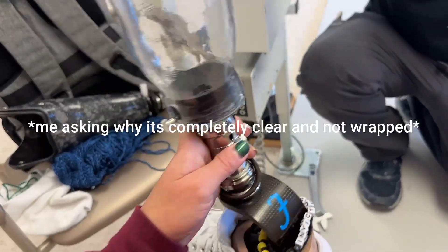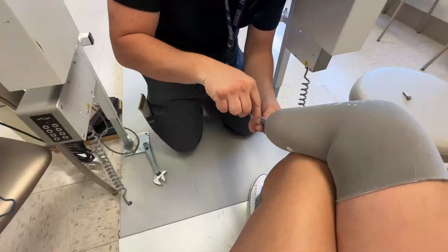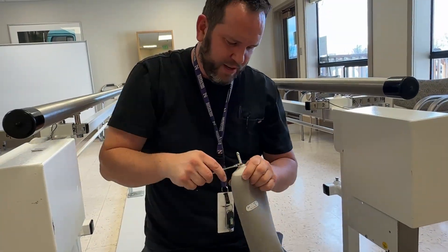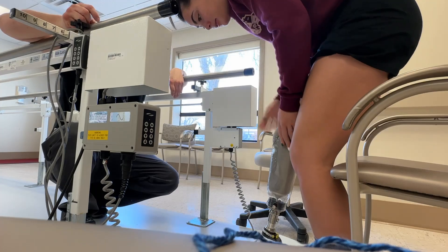Sometimes people's nerves have kind of remapped, so you'll say it's hurting here and I'm seeing that it's actually hitting pretty hard just a little bit off. I didn't want to get too aggressive, so I'm guessing we probably have to wear socks.